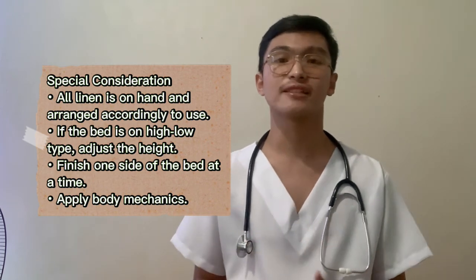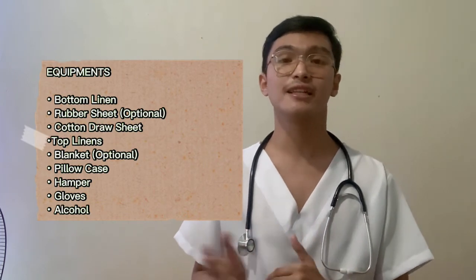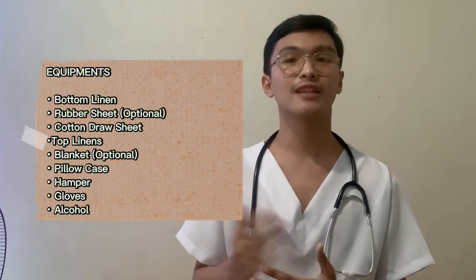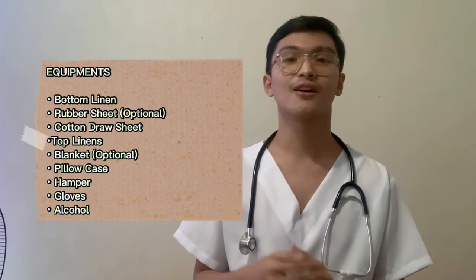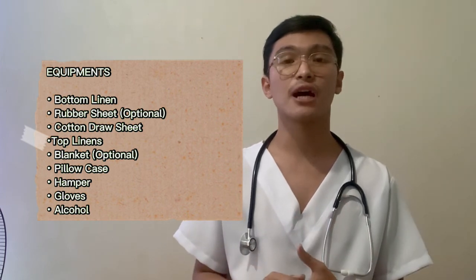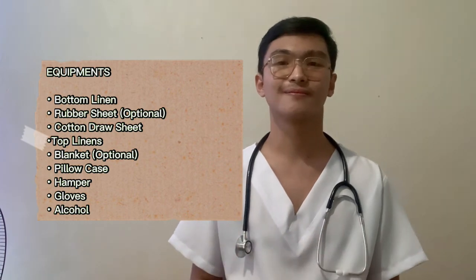Next, here are some of the materials or equipment that we will be needing in bed making. Bottom sheet, top sheet, blanket, cotton draw sheet, pillowcase, hamper, and of course our PPE, the gloves, and our alcohol.